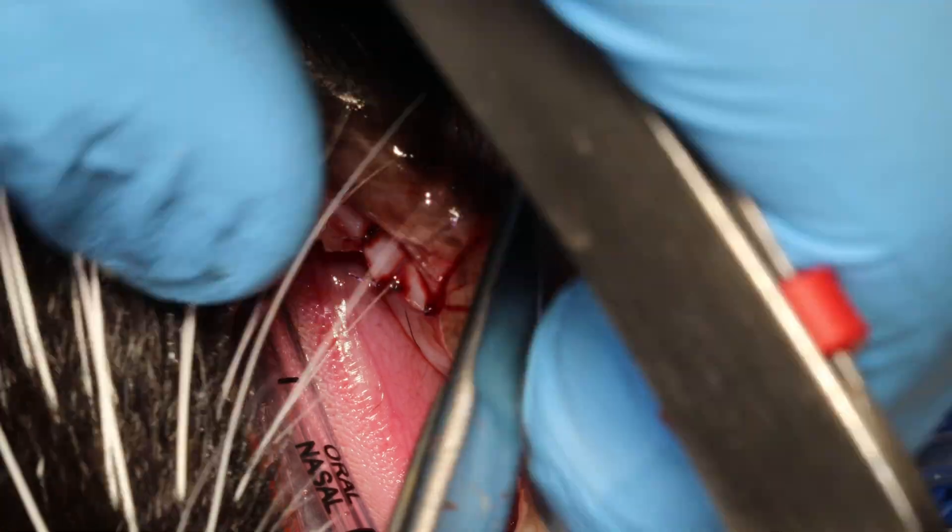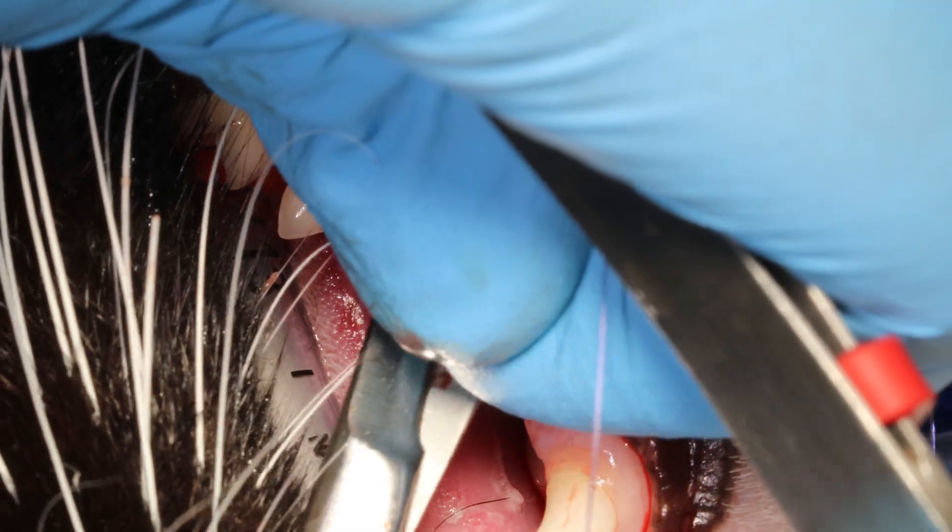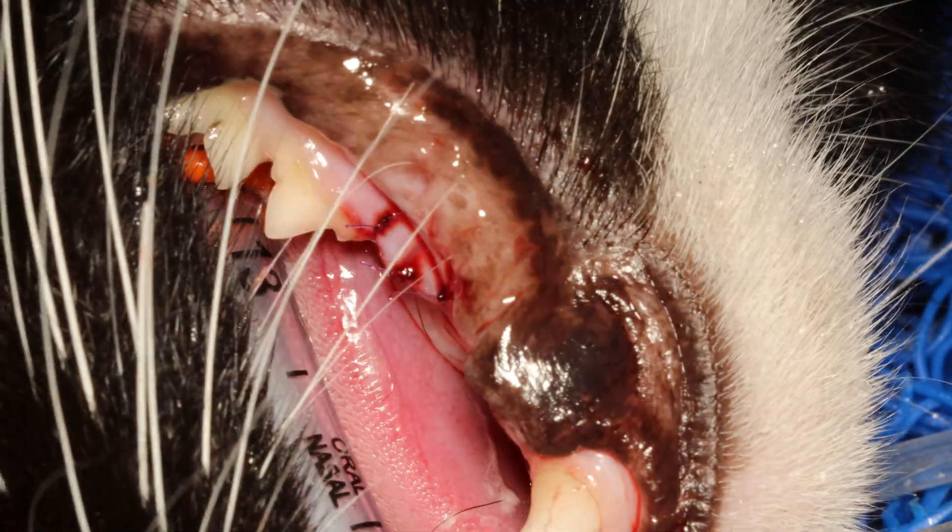That was the crown amputation of a type 2 tooth resorptive lesion.